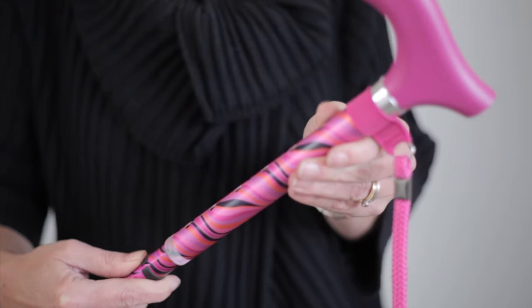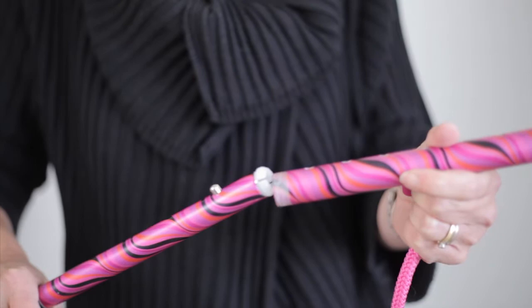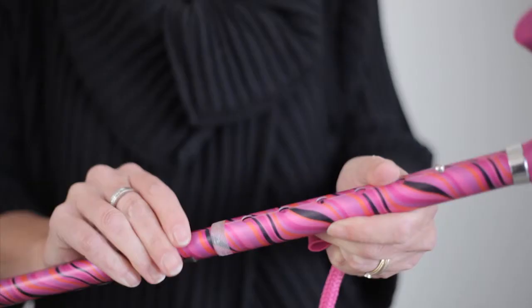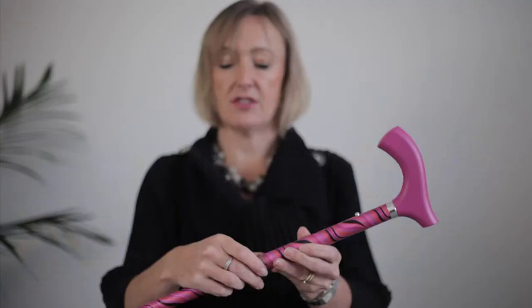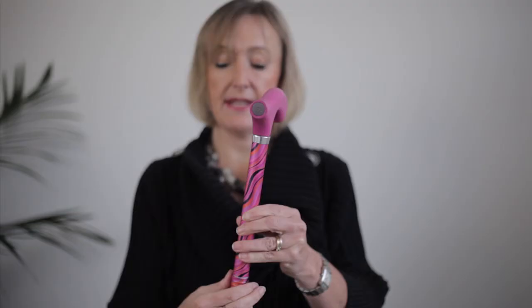And then you can take the wrist strap off and then put it back together again. Push the pin in, slide it up to the right height obviously. And then remember you find your little plastic washer and then you screw that back on. And you now have a stick without a wrist band.